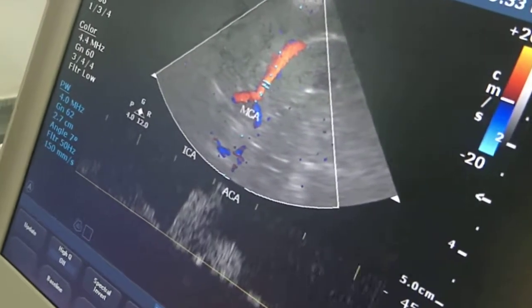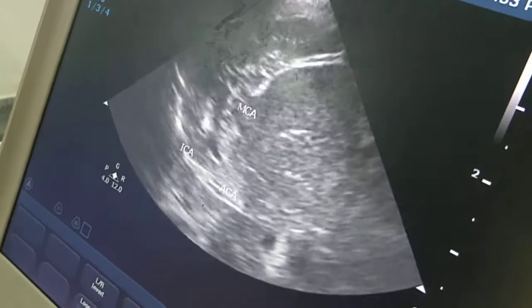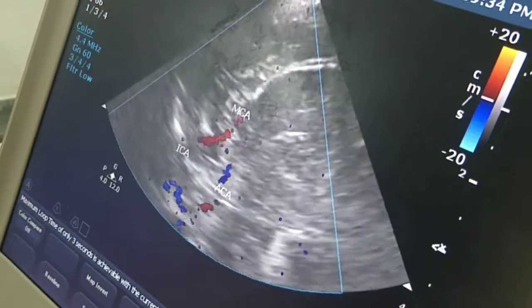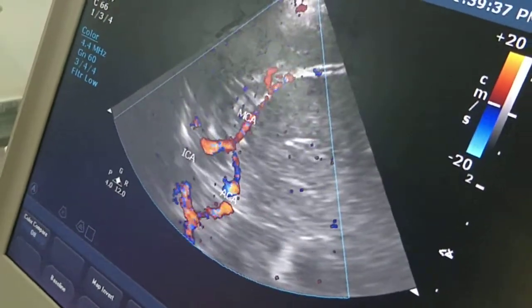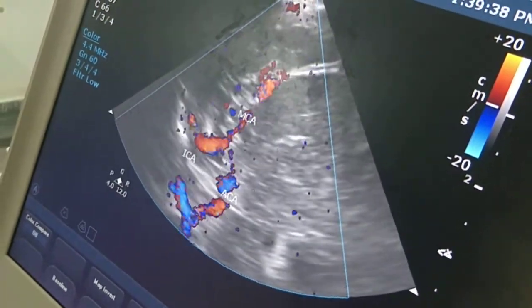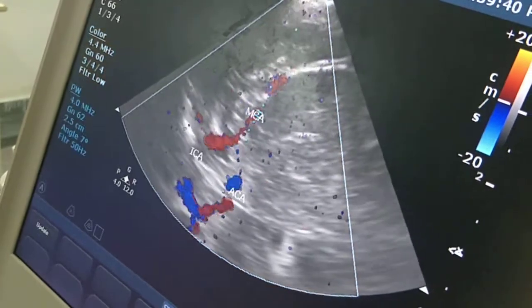Just to get a better image — this is the pulse of that one.